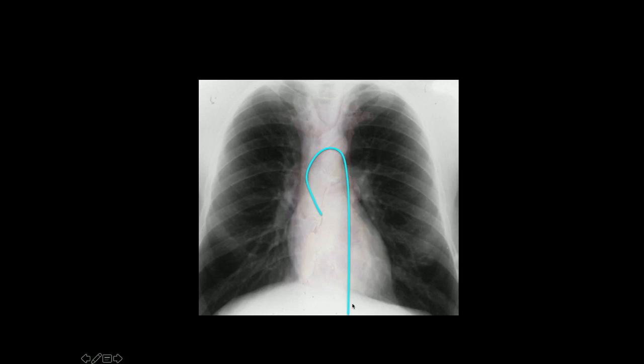Okay, and then this is going up the left side of the spine and around. So what does that look like? A left aortic arch. Good. And then to the left ventricle. And again, you would want to see that you're in a left-sided posterior ventricle, and you'd only know that on the lateral view. Where is that going?